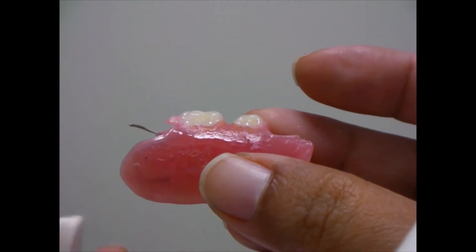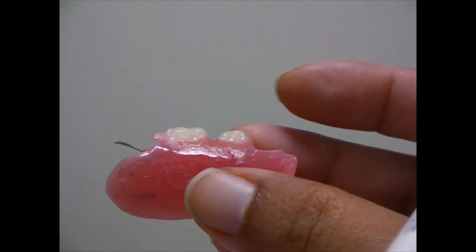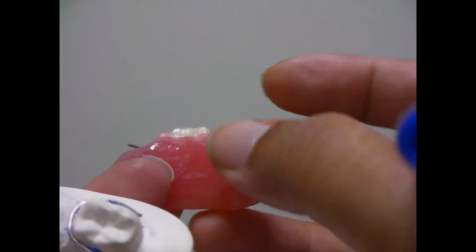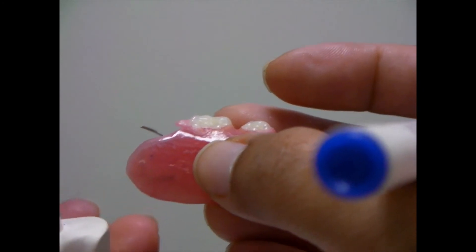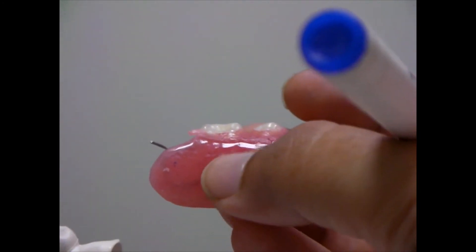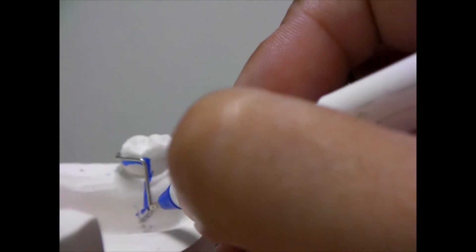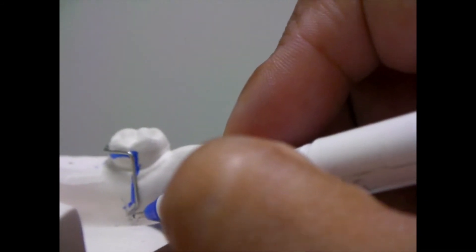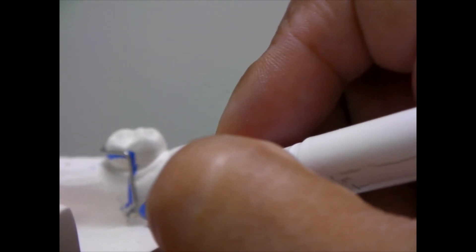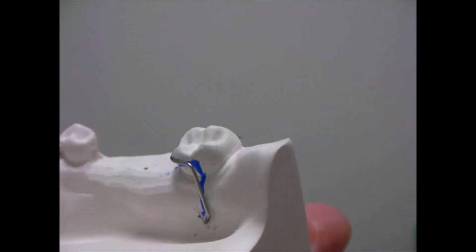So now you cannot see this part because it has been incorporated inside the acrylic but what it does is actually it has connected the clasp to the acrylic or the lingual plate. And now from this minor connector downwards you see there is a small projection over here and this projection is known as the retentive tag. So these are the parts of the circumferential clasp.